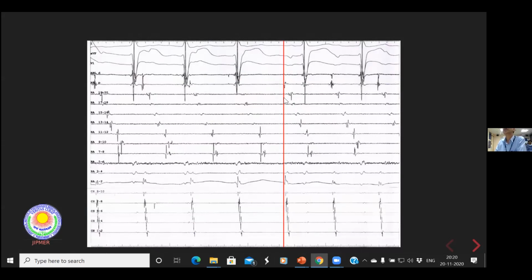But when there is a possibility, in cases like this, where it could be either focal or re-entry, see that the window onset is sufficiently early from the P wave onset so that if it is a focal arrhythmia, early points will not be marked as late.